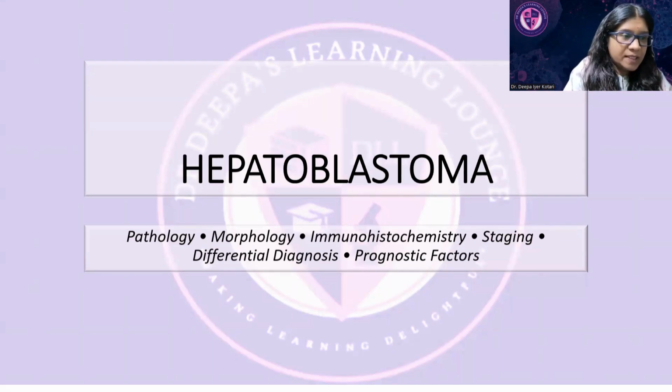Today we will be discussing hepatoblastoma, which was a case that I shared with you guys last week. So we will look at the entire pathology. We will look at the morphological patterns. We will look at the IHC staging, differential diagnosis, and the clinical aspects that every pathologist should know before reporting it out, because you need to converse with the clinical side also. And I will also be telling you the prognostic factors, which are very, very important for hepatoblastoma.